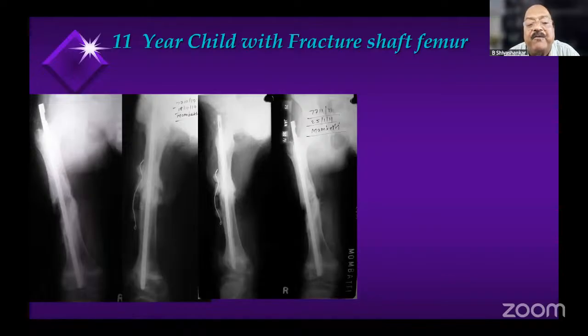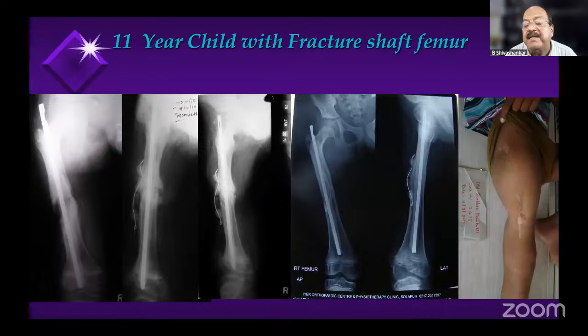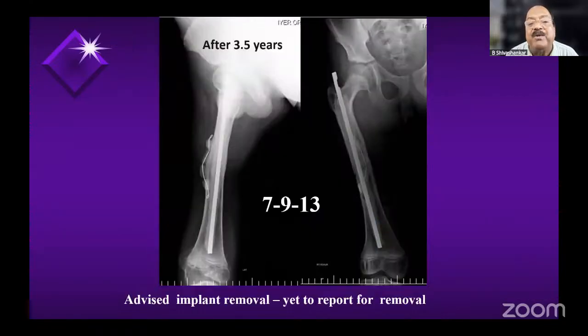The fracture got healed. Unfortunately, the patient has never come for implant removal. Even now, after 15 years, he has not come to me. So this is at 3.5 years. You can see the fracture has united, but the antibiotic coated nail is still inside.